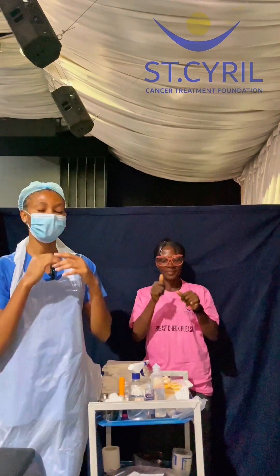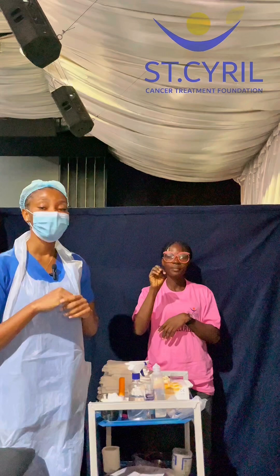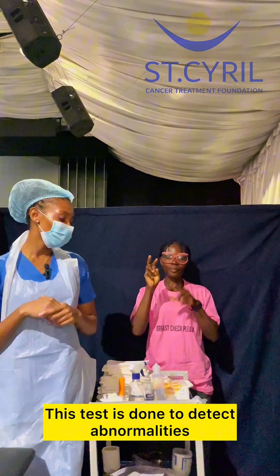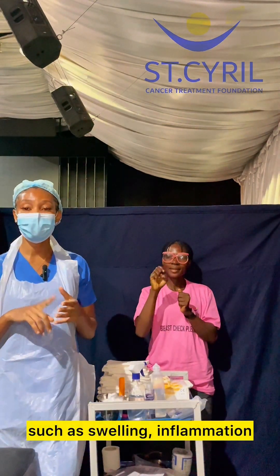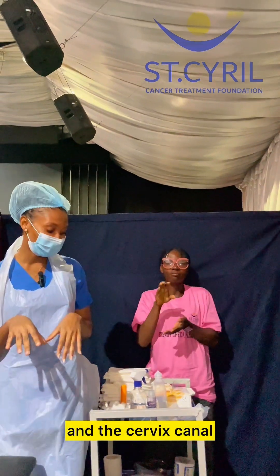Hi, everyone. I'm here to conduct a cervical cancer screen with acetic acid. This test is done to detect abnormalities such as swelling, inflammation, and discoloration of the cervix and the cervical canal.